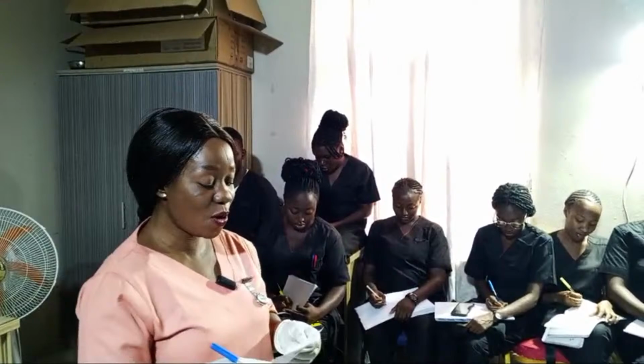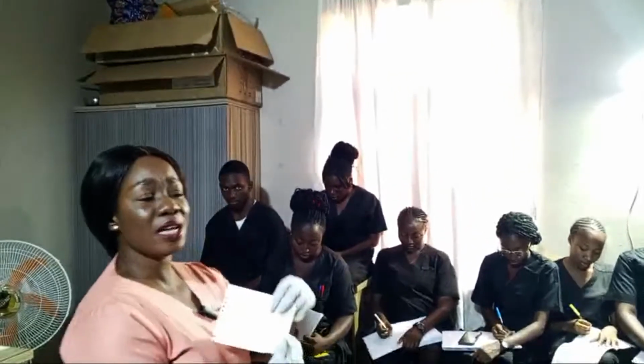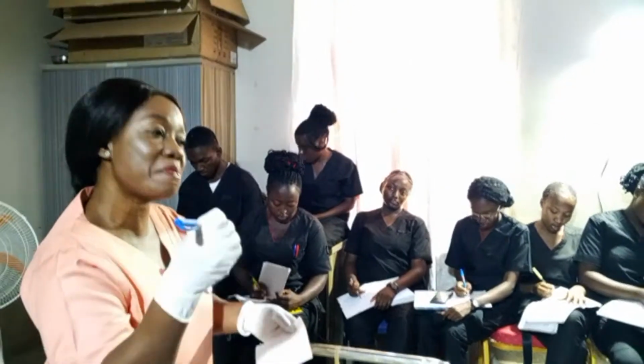And A stands for what? Who can guess? Amount. A stands for amount. Then S stands for what? Specific gravity. So now that we have written DORCAS, it will guide you to do the physical examination step by step.